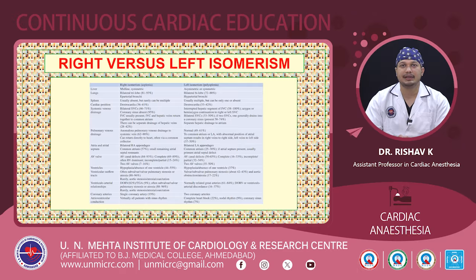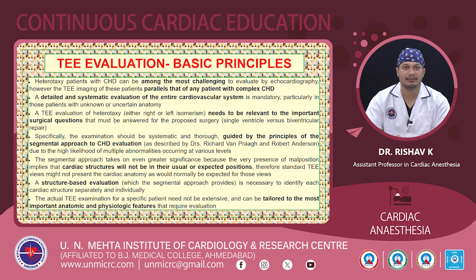And there will be significant differences in the systemic and pulmonary venous drainage also. So we can summarize the entire findings of right versus left isomerism in this table. Now coming to the TE evaluation, that is the basic principles.